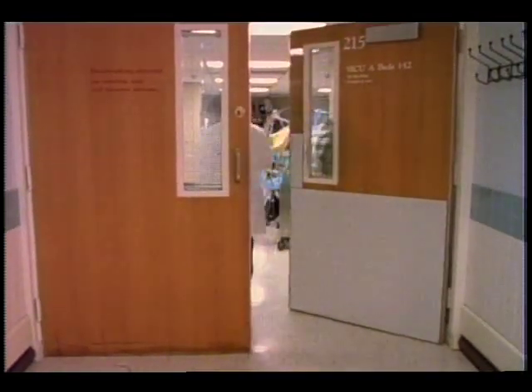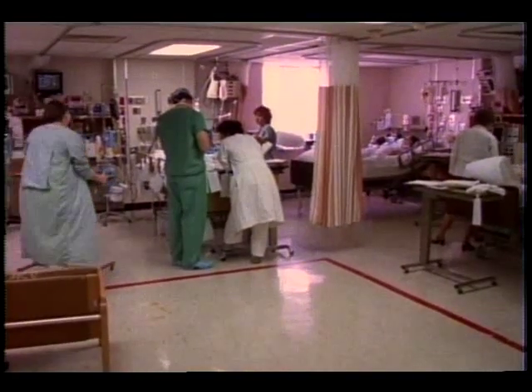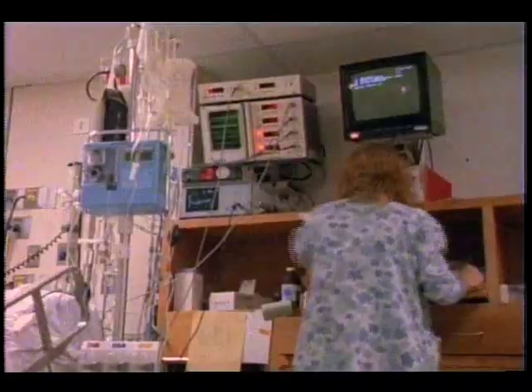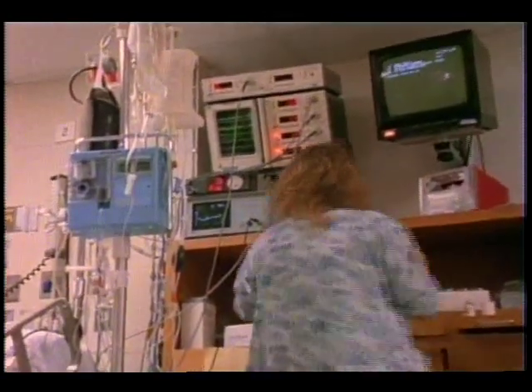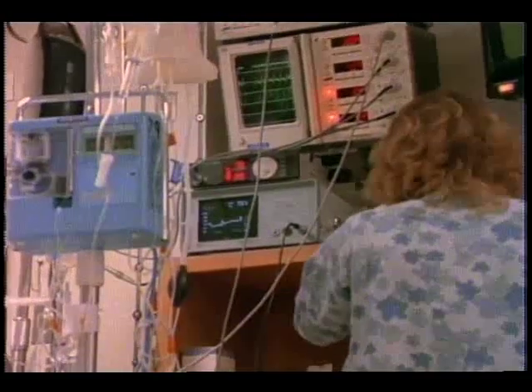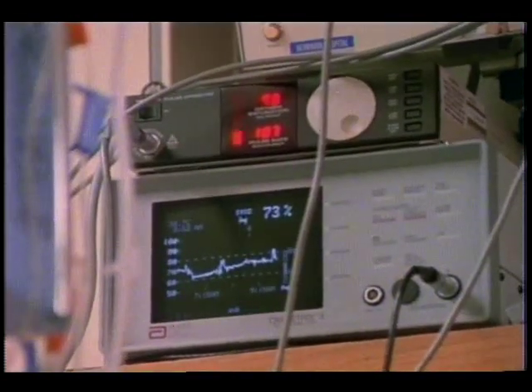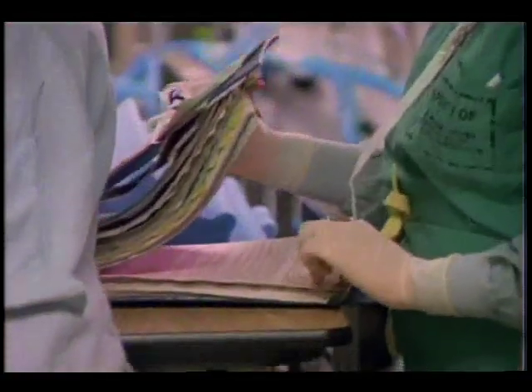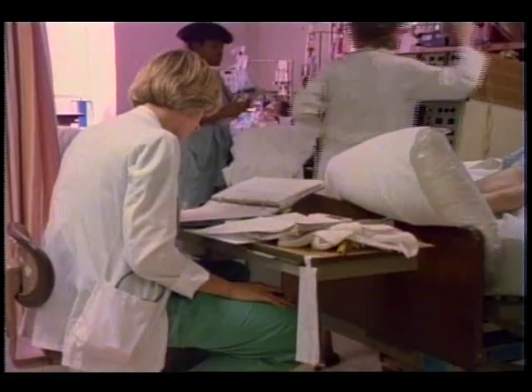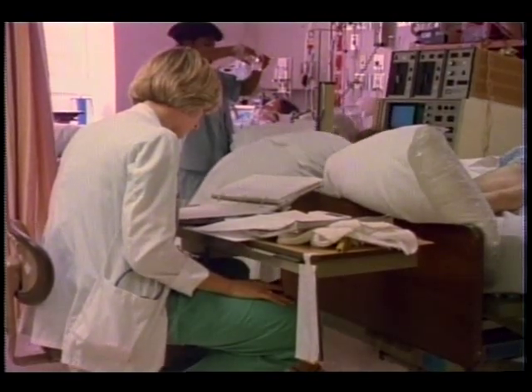Also, the medical information bus can improve the quality of care in areas such as a hospital intensive care unit. By integrating the information gathered from all the monitoring equipment, the medical information bus will simplify the various equipment connections and eliminate most of the paperwork burden. This will allow the care providers more time to spend in direct patient care.